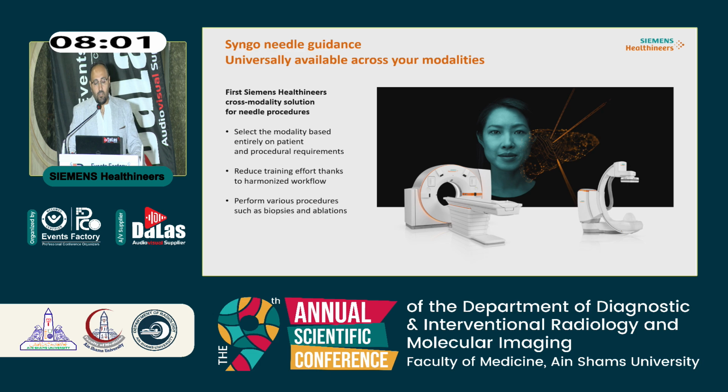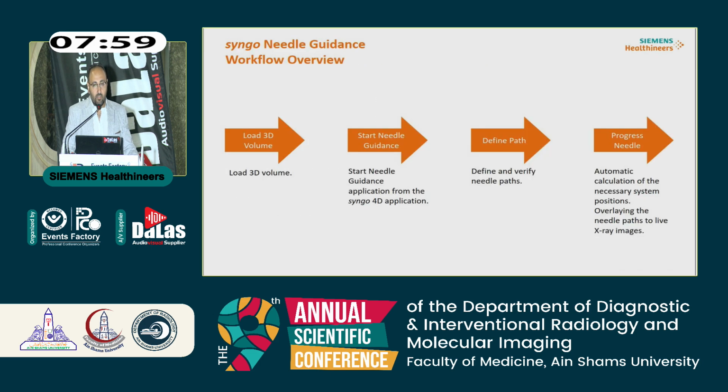In needle guidance software, the workflow is very simple. I just need to take a CT, and then the physician is going to draw his path, the target point and the entry point.